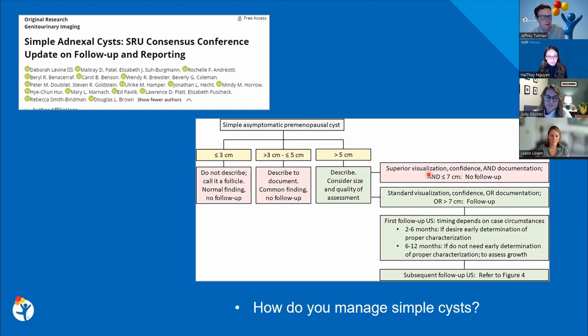And then similarly, for a hemorrhagic cyst, like you had mentioned previously, do you have a size cutoff where you just let it go versus when you would recommend that 6 to 8 week follow-up? What's your approach to hemorrhagic cyst situations? Size. I extrapolate from the adult population, even though pediatric patients are excluded. But it also depends on what it looks like. If the patient has pain, I feel like typically they end up going on for concern for superimposed torsion anyway. Right.